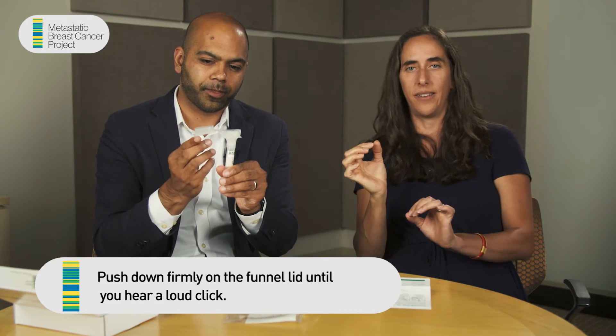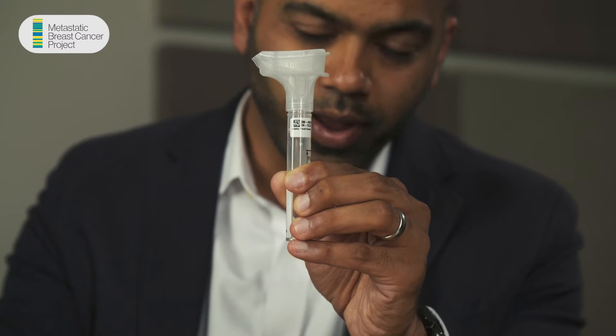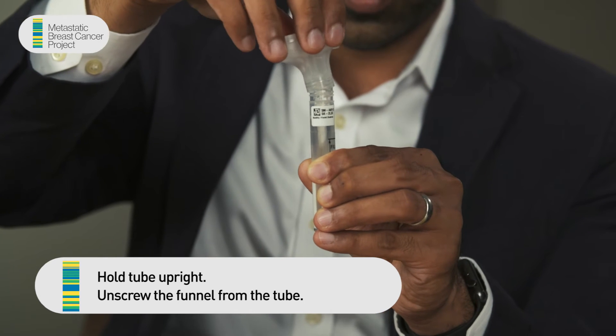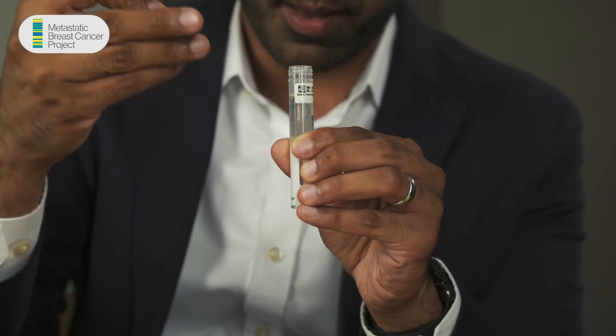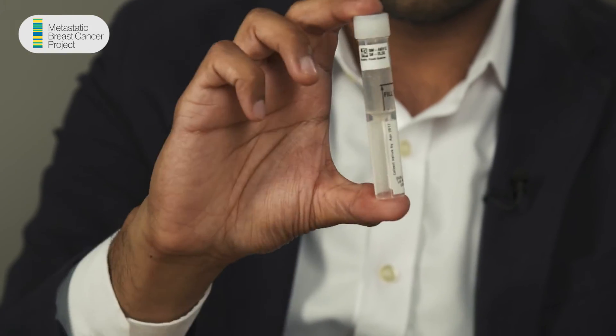Now you're going to flip the top of this over — it's got liquid inside that's going to neutralize the saliva. Flip it over and click it down. Do you hear that? Now twist that top off and unscrew it — you can just go ahead and throw it away. There's a little bubble there, that's okay, no problem. And there's the cap that came with the kit — close it up. Now shake that for five seconds: one, two, three, four, five.